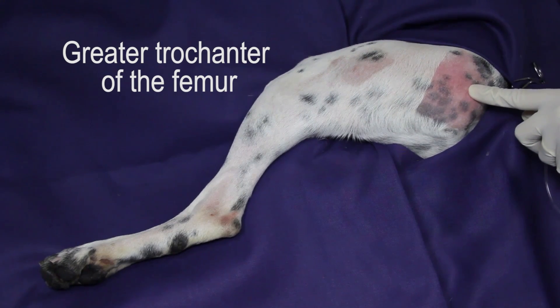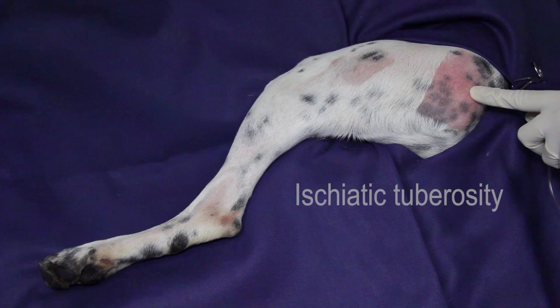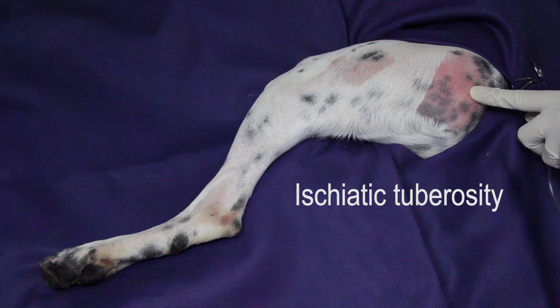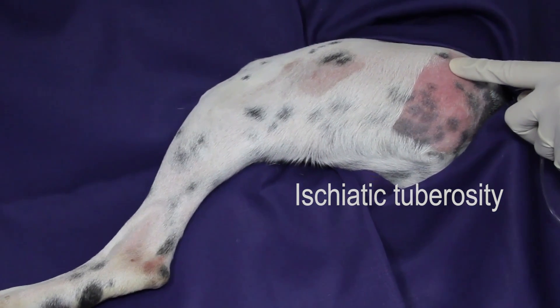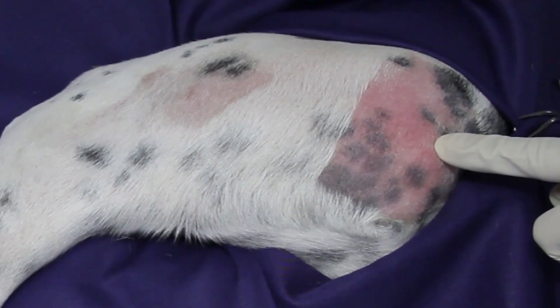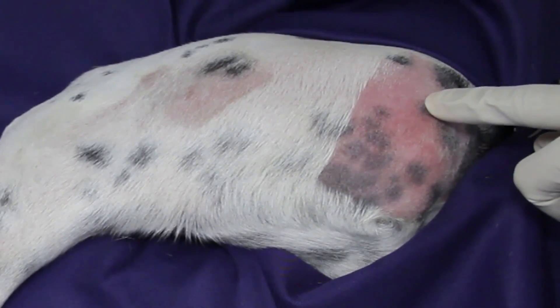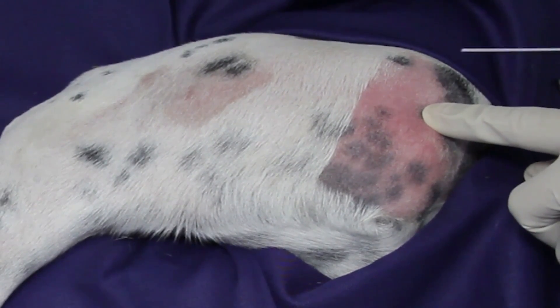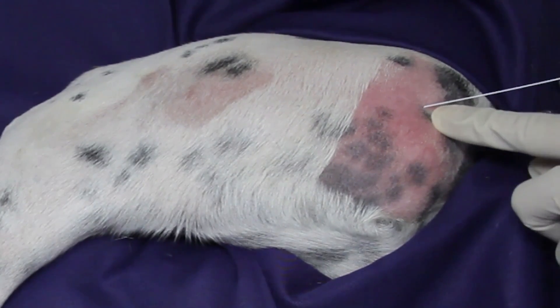Both the greater trochanter and the ischial tuberosity are identified. An imaginary line is drawn between these two structures. Under aseptic conditions, an insulated nerve stimulating needle is inserted along this imaginary line, between its cranial and middle thirds.